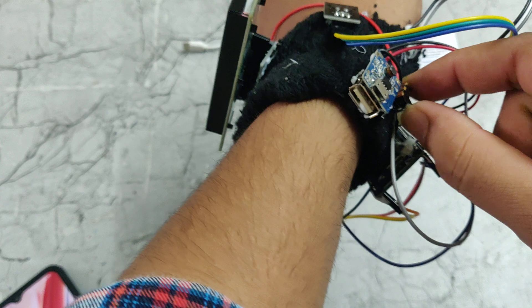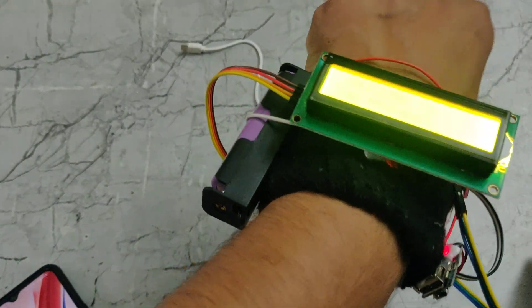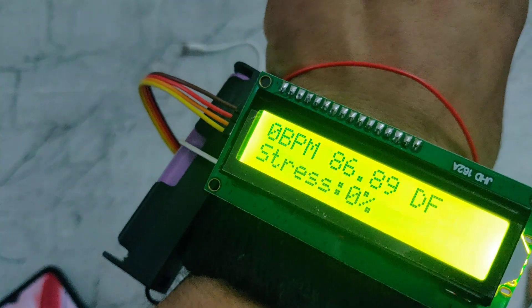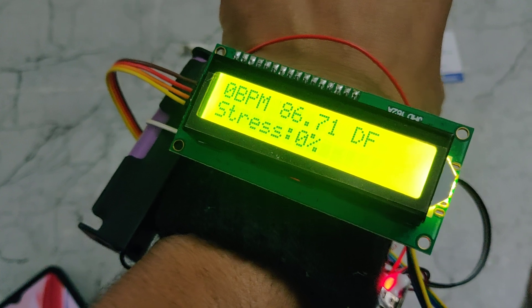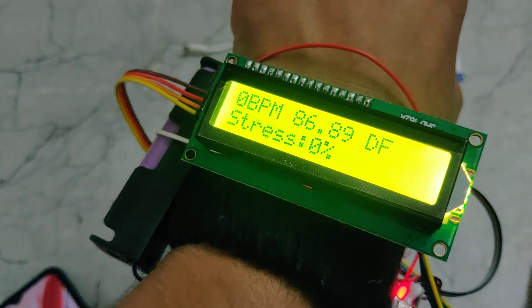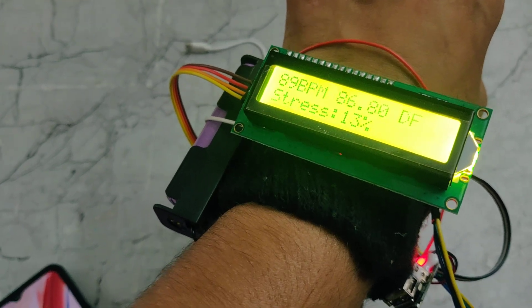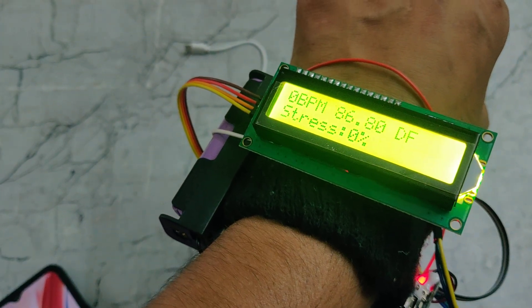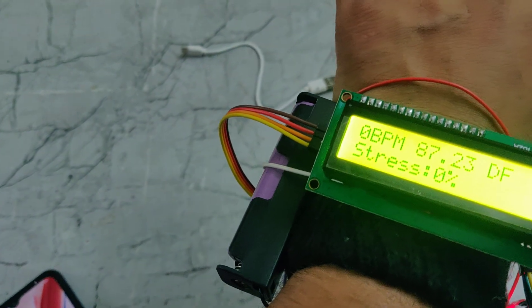Now I am giving the power supply. We can see it is showing the welcome message on the display. We can also see BPM and DF — which means degrees in Fahrenheit — as well as stress levels and BPM values here.